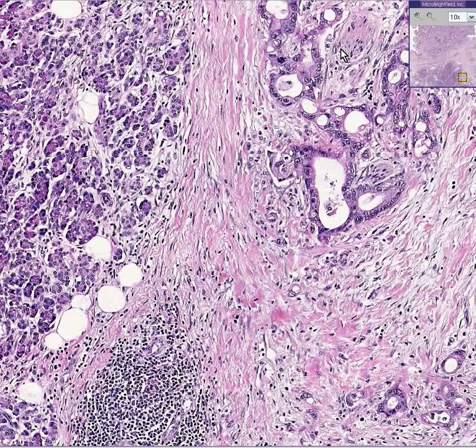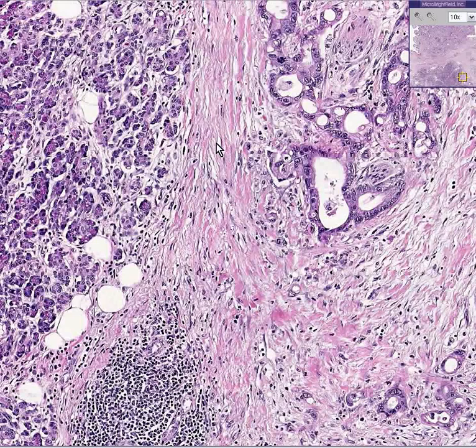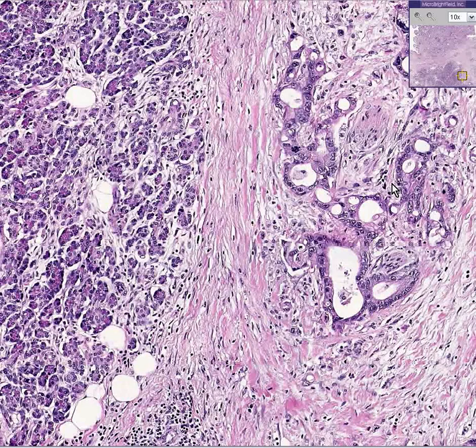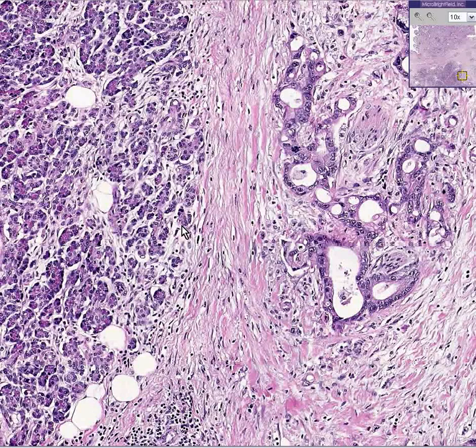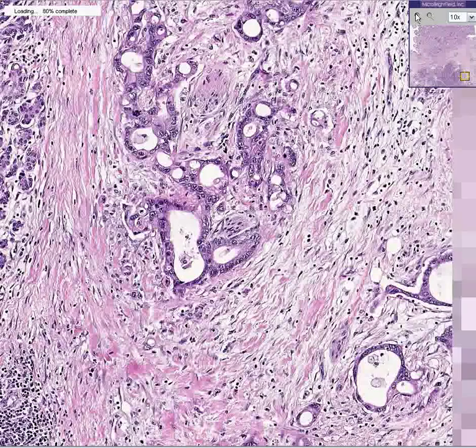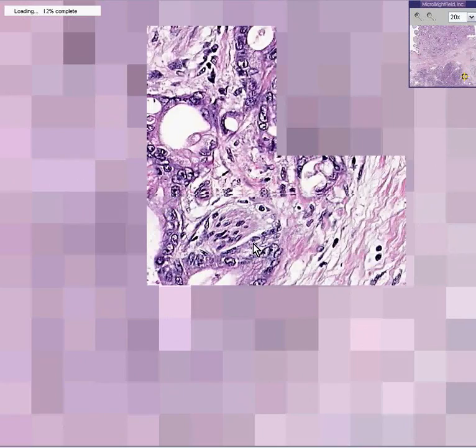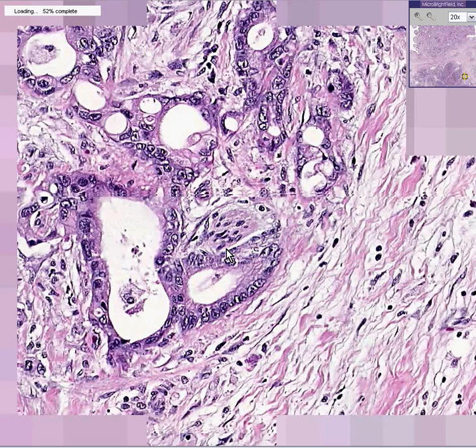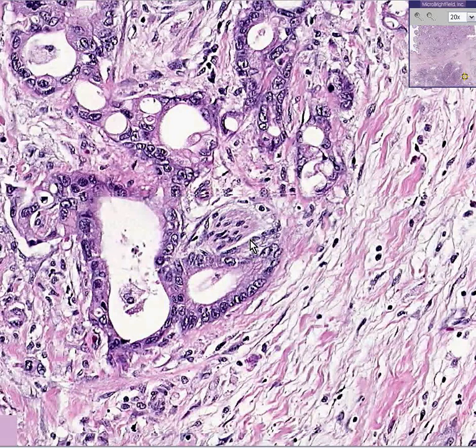You can see some other infiltrating glands here. This is a great slide because it shows normal glands and malignant glands side by side. The malignant glands have big, dark, ugly, pleomorphic, hyperchromatic nuclei and are growing haphazardly — they are not conforming to this lobular type of growth in which you have little groups of acini. In addition, you can see that they are invading around this little nerve right here. And here's another little nerve that has some tumor around it. If you see a normal-looking nerve but there happen to be epithelial cells surrounding it, you know this is cancer, because nothing would grow in the nerve sheath except for cancer — and it's usually adenocarcinomas.